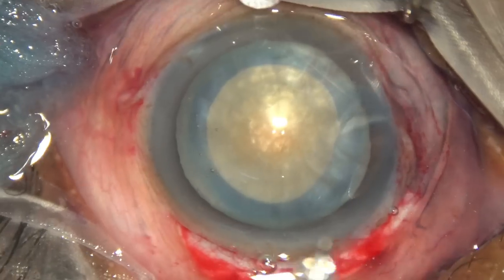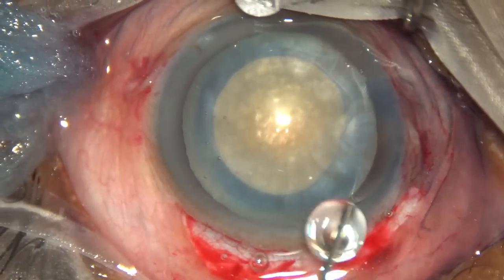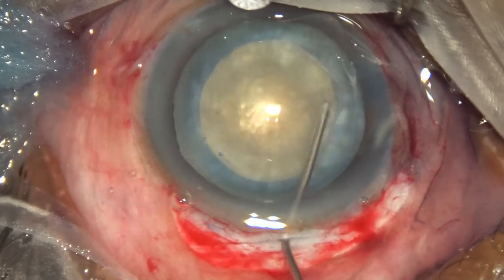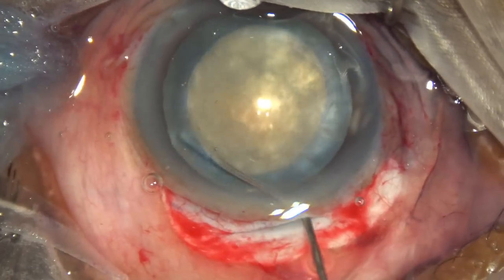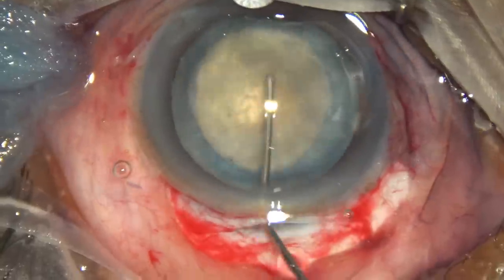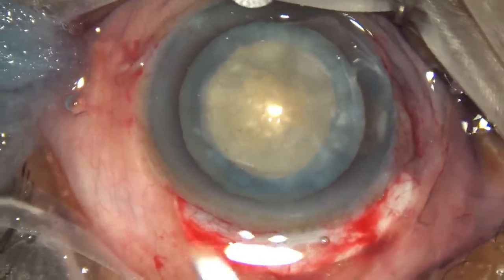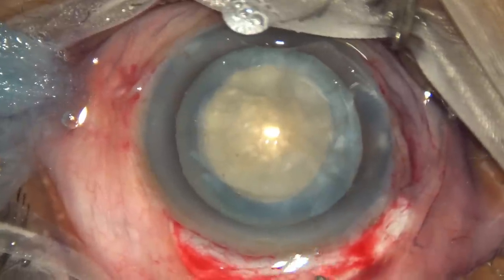Now we have to prolapse this large nucleus through this opening. Let us see if it comes out easily. Otherwise, we have to make some radial cuts.